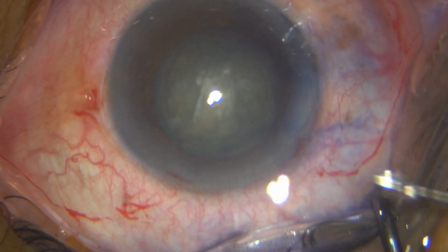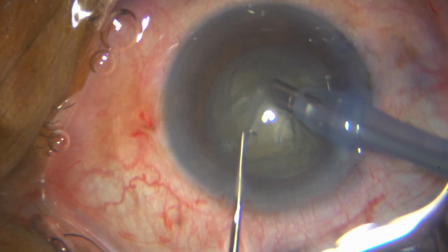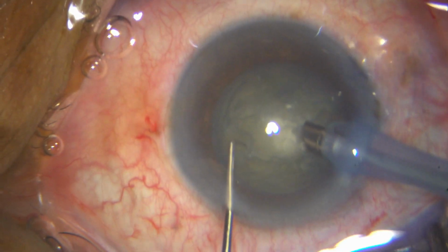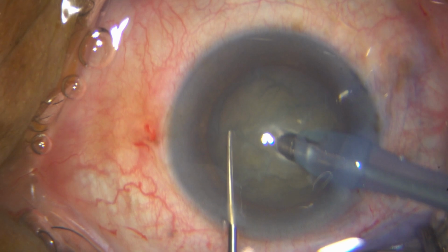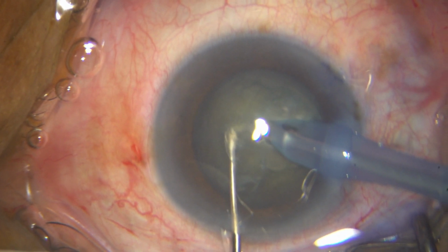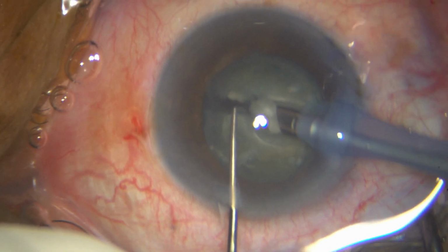Then under HPMC, I take a sharp chopper in my left hand, my phaco probe in my right, aspirate the superficial cortex, and I am good to chop it. I usually perform a woodchopper's technique, and my parameters are: the bottle height is around 100 centimeters, the AFR is 40 ml, the vacuum is set at around 400 millimeters of mercury.